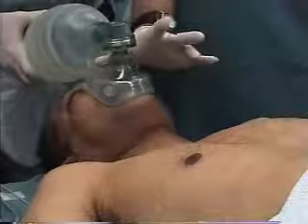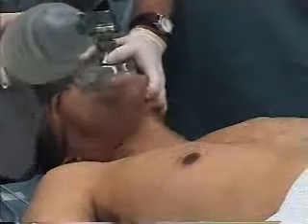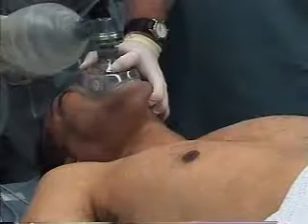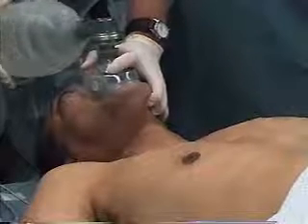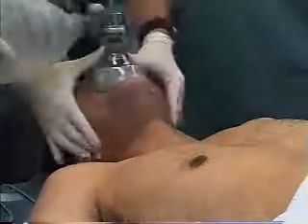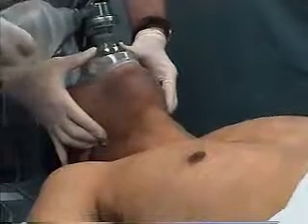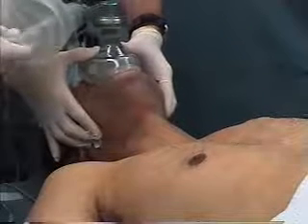Place the mask over the patient's nose and mouth, with your thumb over the patient's nose and your forefinger below the mask's ventilation port. Lift the jaw with your other 3 fingers, squeeze the bag, and observe for chest movement and misting in the mask. If there's a leak around the mask, use 2 hands to hold the mask and have an assistant squeeze the bag. If you're still unable to ventilate, the patient must be intubated.